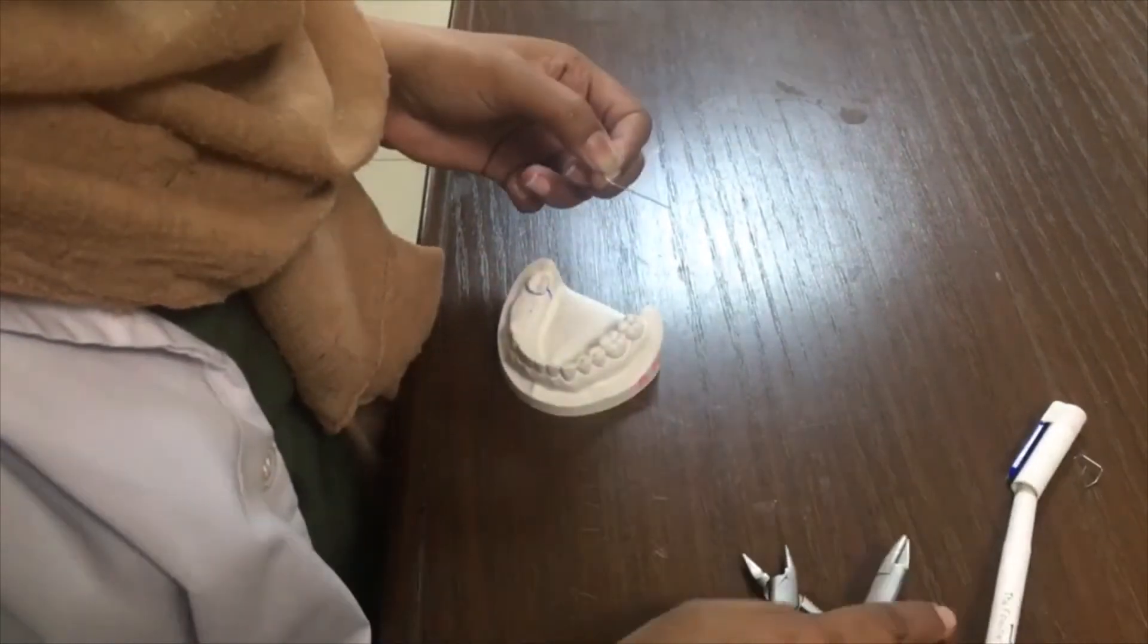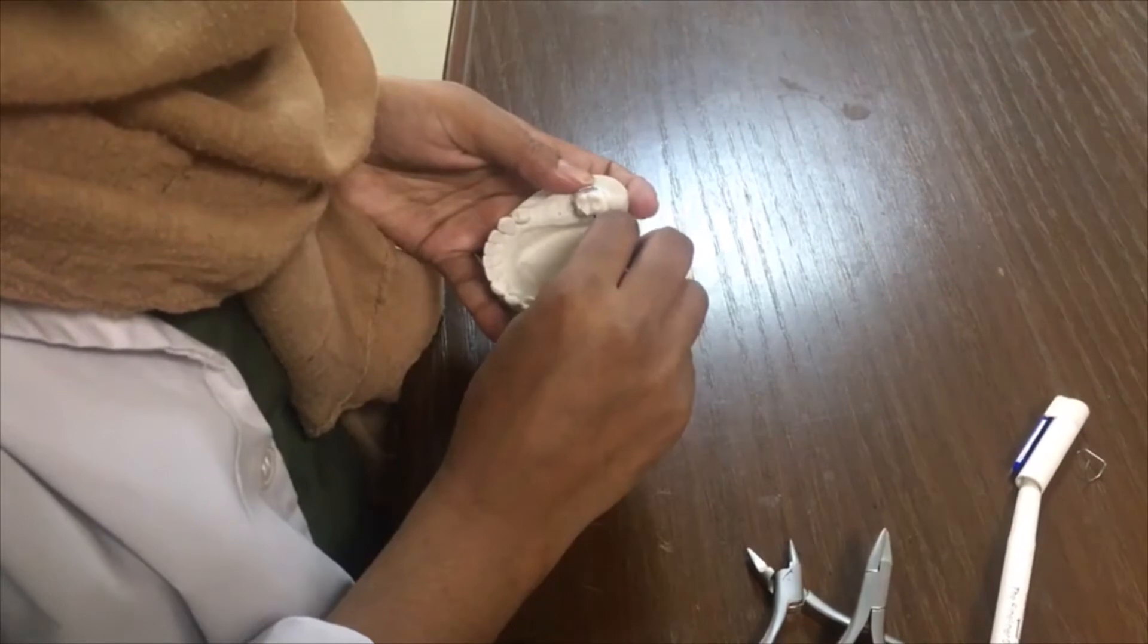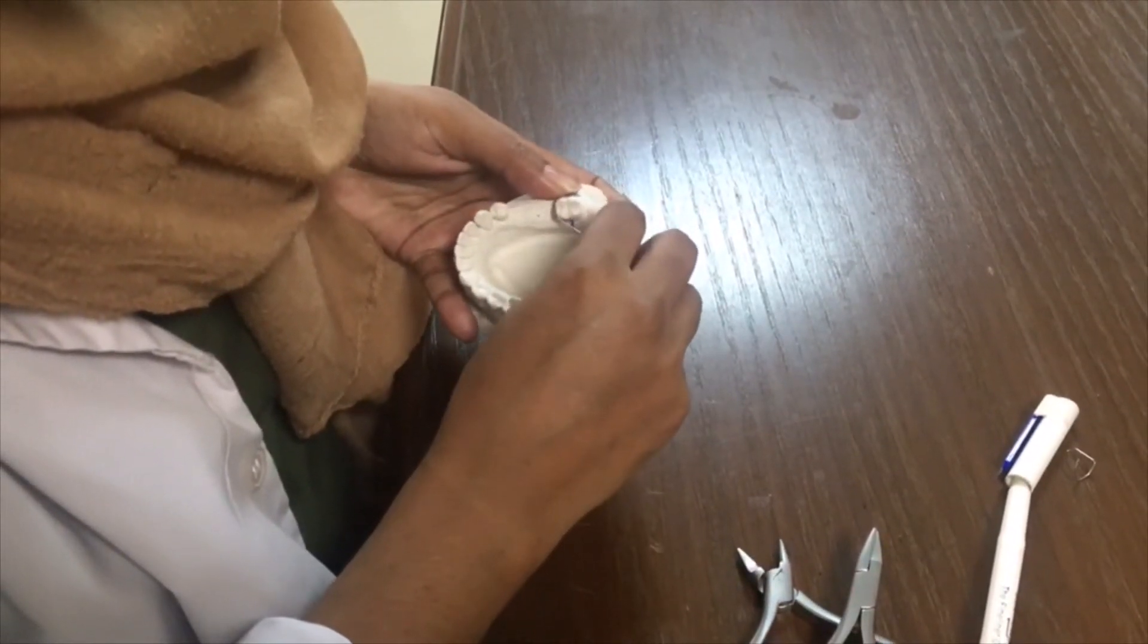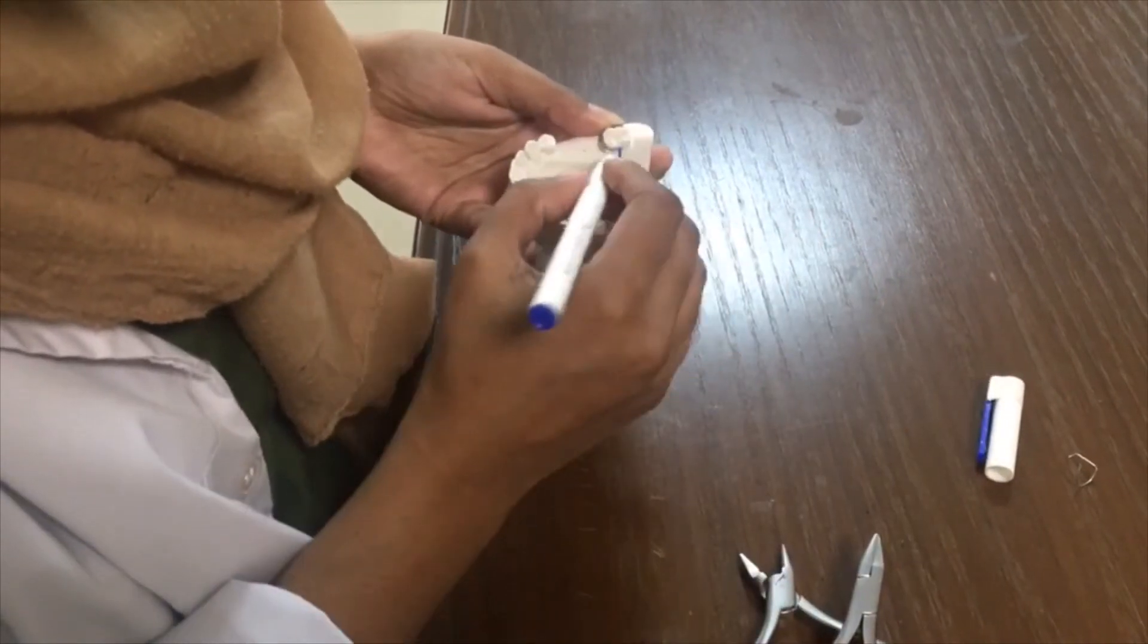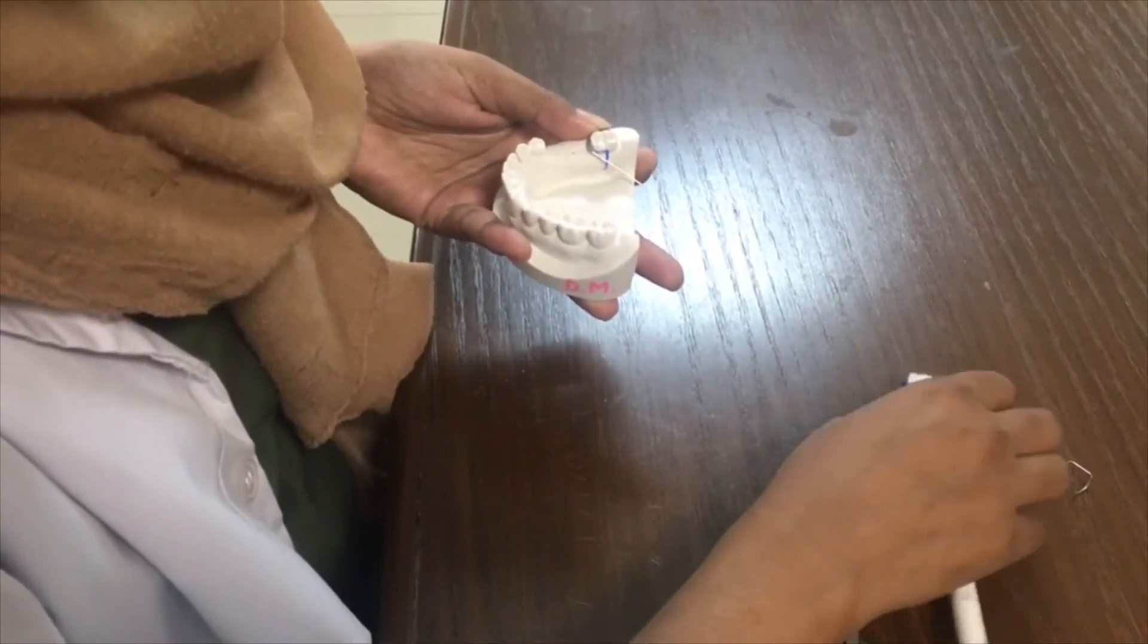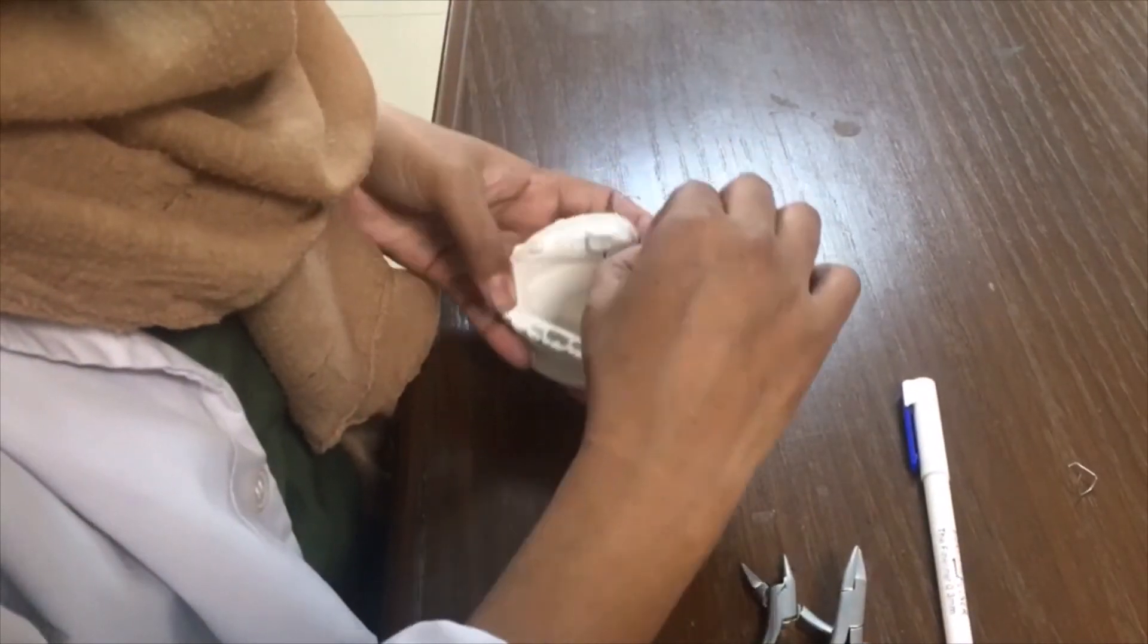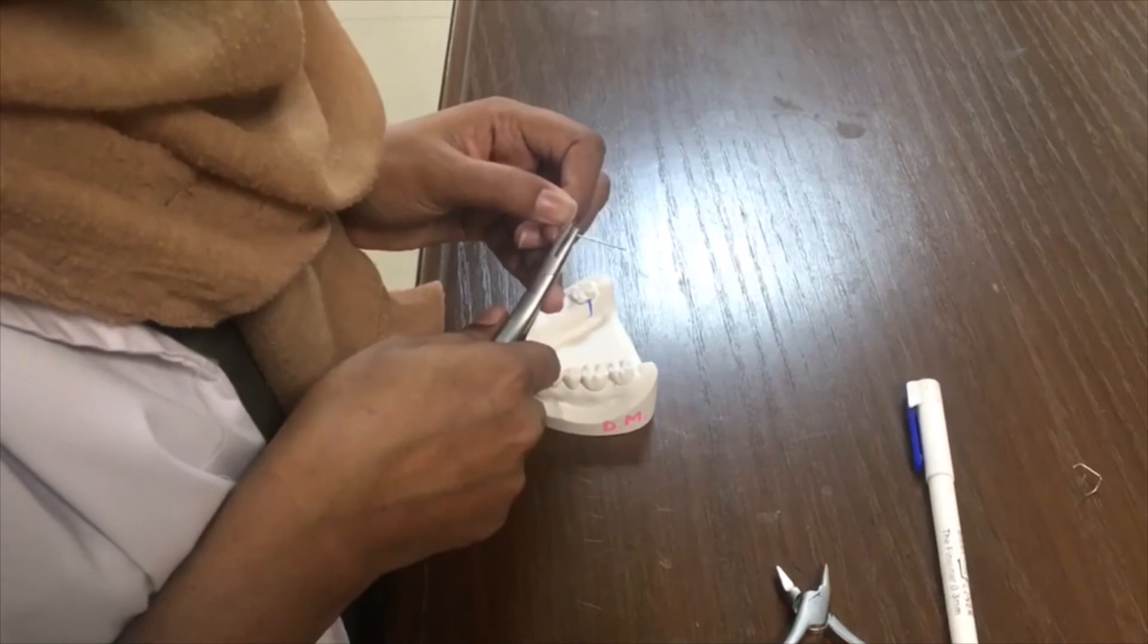The only difference is here that you are now adapting your wire on the surface of the tooth instead of on the template. You have to follow the contours of the tooth and keep a marker handy so that you can mark wherever you have to turn the wire and then turn the wire according to the mark that you have made.